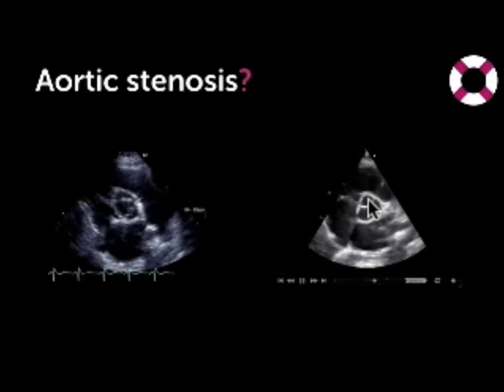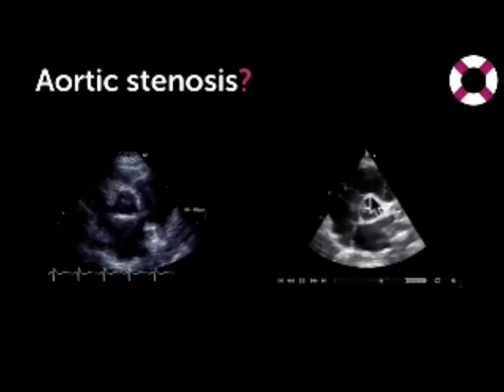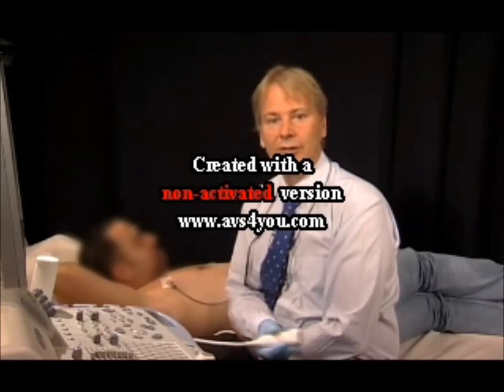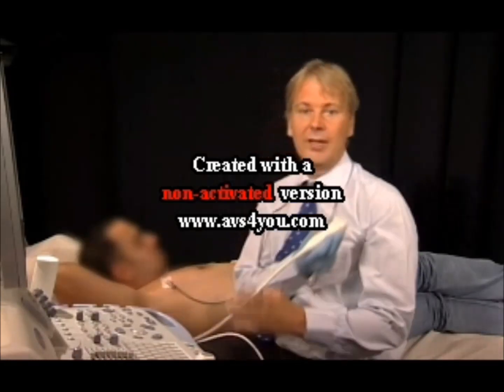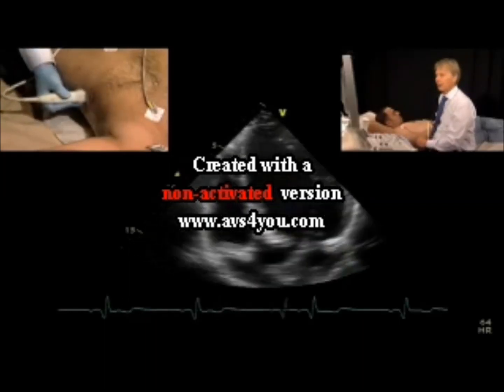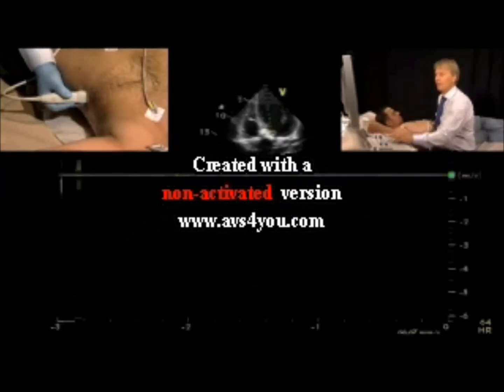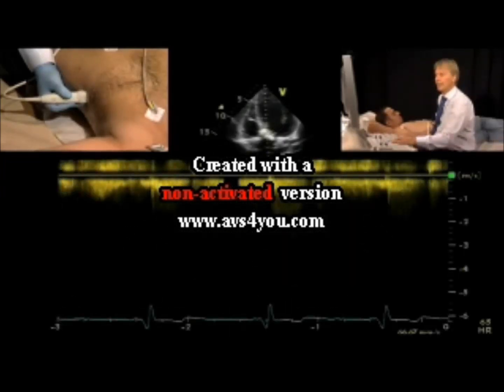In the normal patient, the cusps almost touch the aortic root at full opening, while this is not the case in aortic stenosis. To quantify aortic stenosis with CW Doppler, start from the apical approach, get an apical five-chamber view, and place the continuous wave Doppler spectrum right inside the valve.